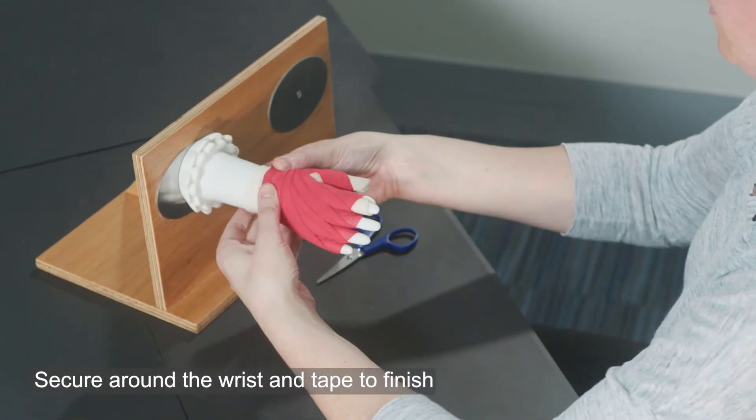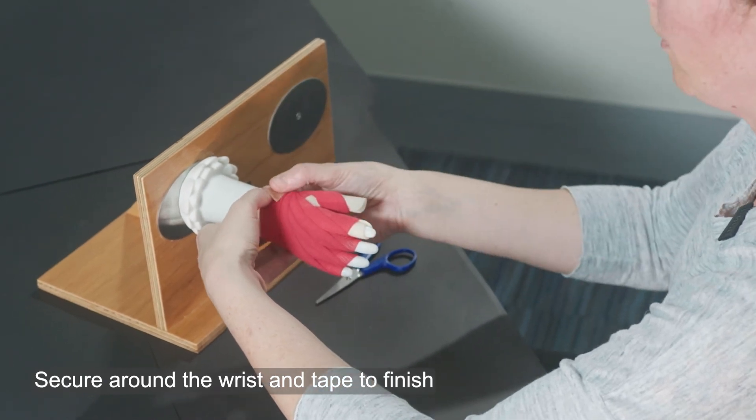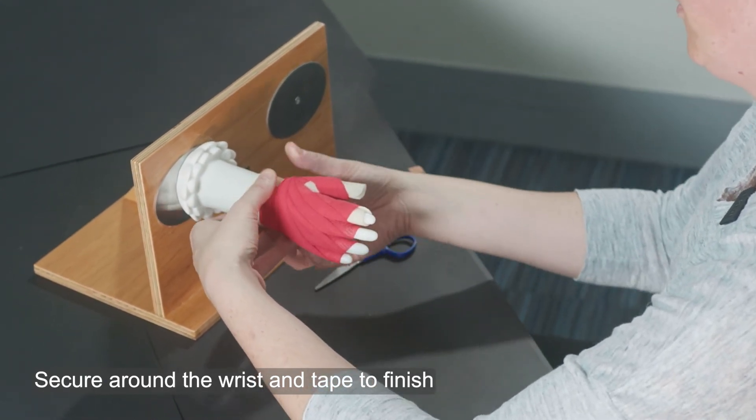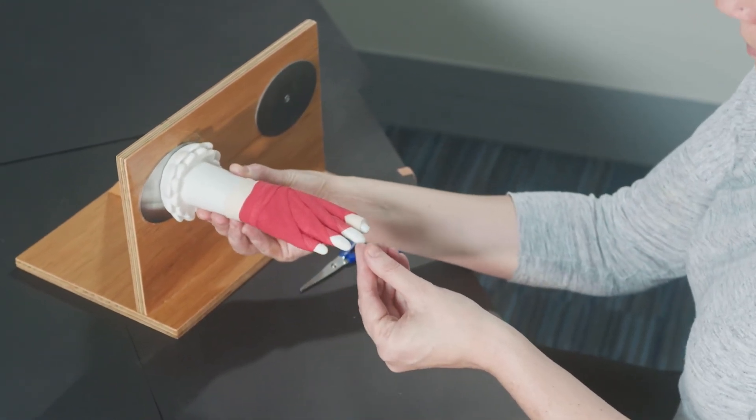Take your scissors. You're just going to get a little piece of tape, again all pre-prepared, and just secure that down. That's what it looks like at the back.